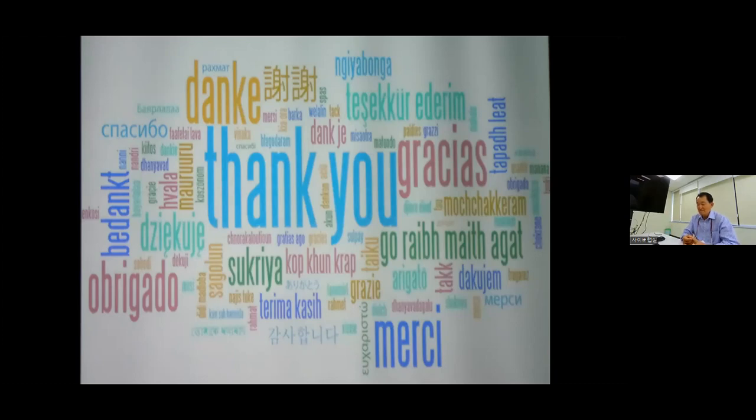you can basically stop at 15 minutes usually, and then you can inject Lasix and then continue to save time. But just 15 minutes doesn't make any big difference. So I'd suggest to just keep the normal half hour study and then inject the Lasix and then repeat another study. That will make a probably standardized technique.